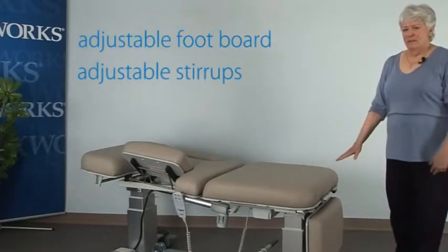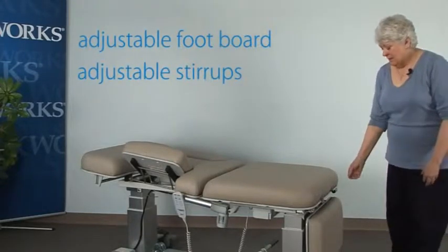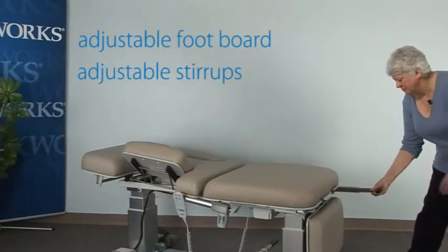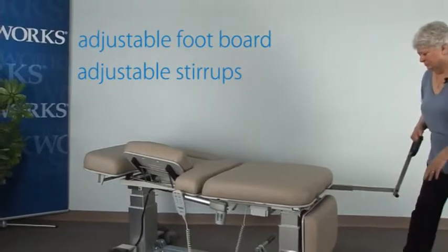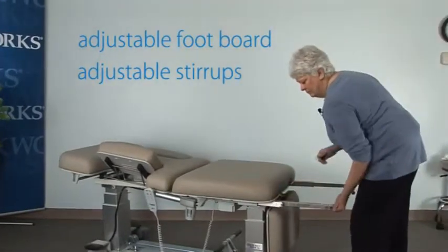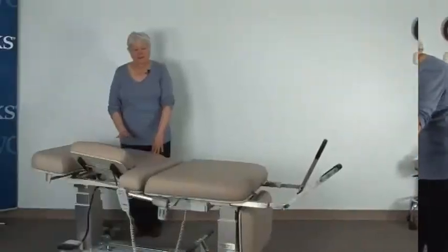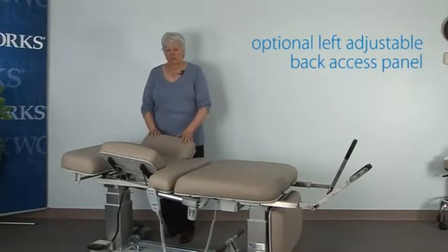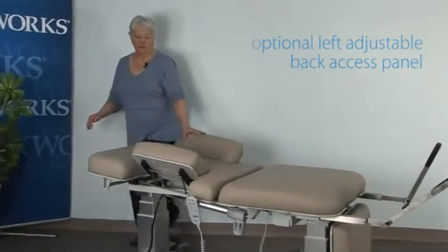This table also comes with stirrups or footrests that have a wide range of adjustability and length. The table can also be equipped with a left access panel in order to position the patient for breast scanning.